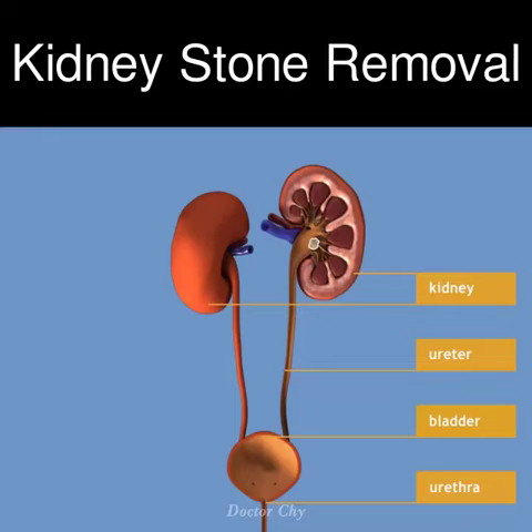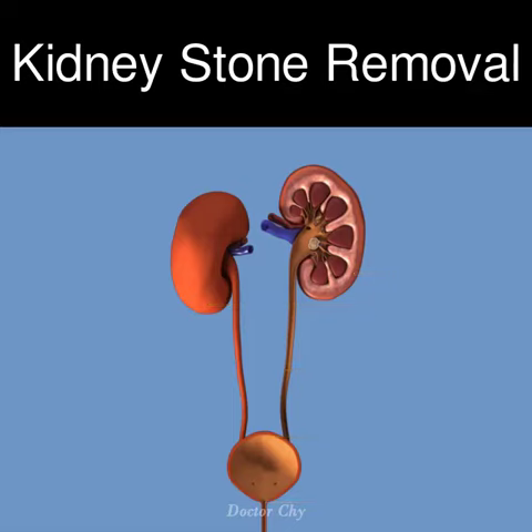Ureteroscopy is used to remove kidney or ureteric stones and enables a direct view of the ureter and kidney to confirm or rule out other abnormalities. This animation shows the removal of a kidney stone.